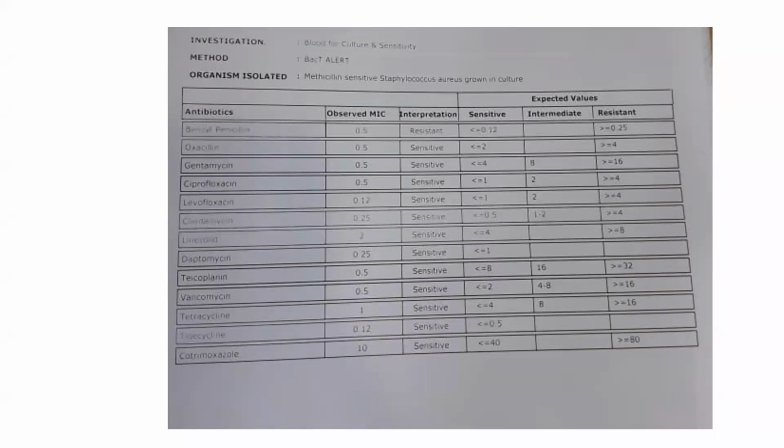Okay. So Bact Alert is basically the liquid culture media. Okay. Bact Alert bottles.